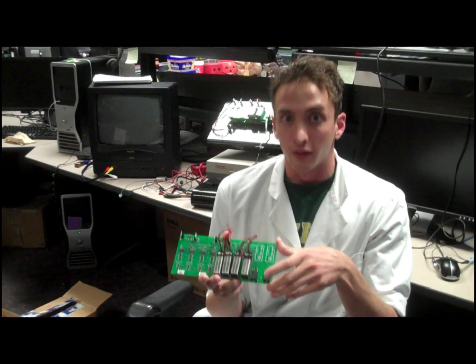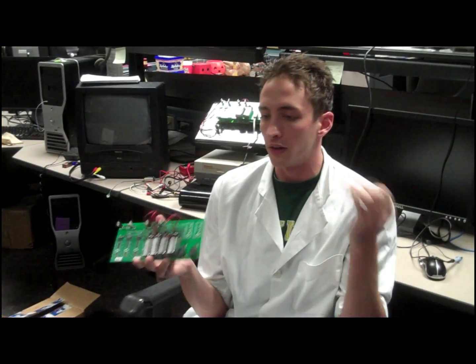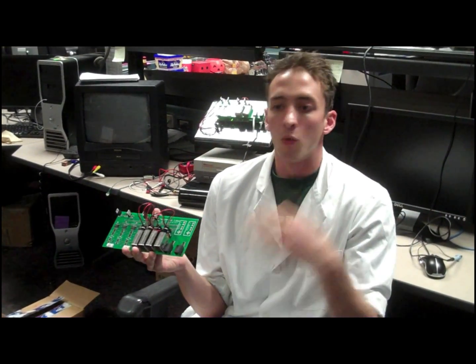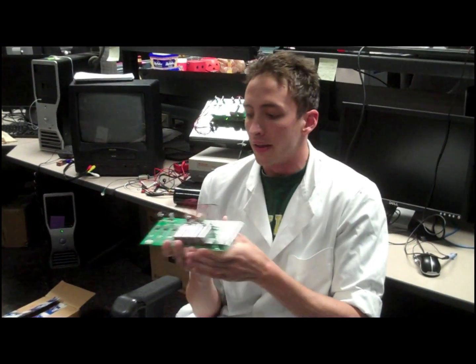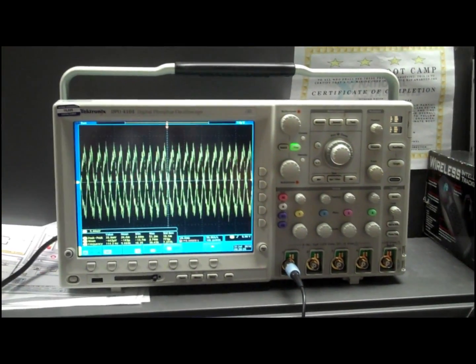Although the electrooculogram signal is large for a bio-potential measurement, it's pretty small compared to the rest of the environment. We're surrounded by electric fields from radio and television stations, cosmic rays, Wi-Fi, etc., and these will all create interference for the signal. Here, you can see the noise that's present in the environment — this is 60 Hz noise from the power mains, plus whatever other interference is in the area. This is actually stronger than the signal we're trying to measure. So how do we pick it up?